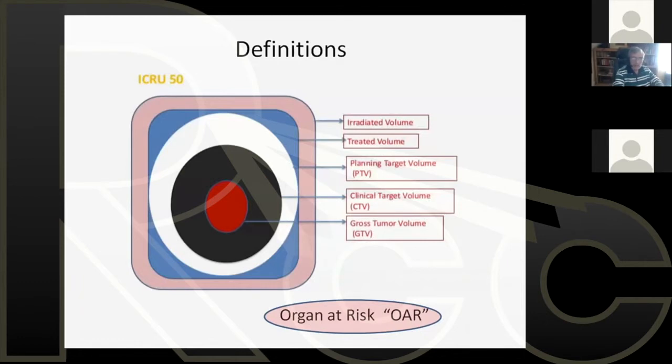My talk is going to be a little more physics oriented. I'm going to be talking about some of the definitions that we use in evaluating plans. And I'm going to be presenting several plans from my center and go over how we evaluate those plans.